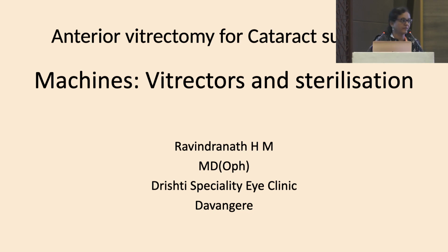In modern day cataract surgery, whether you're a manual small incision cataract surgeon or a phaco surgeon, immaterial, you need to have a good vitrectomy machine with you, because irrespective, all of us, whether we are a novice surgeon or an experienced surgeon, would have a PC tear, would have complications with vitreous, and we need to manage efficiently so that with well managed vitreous disturbance or PC tear, the results are indistinguishable from routine cataract surgery.